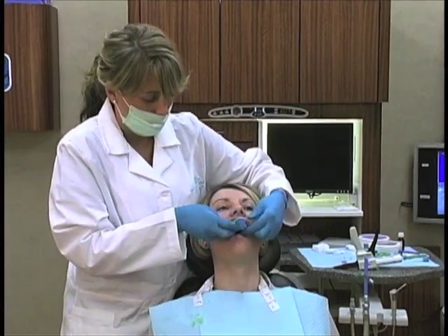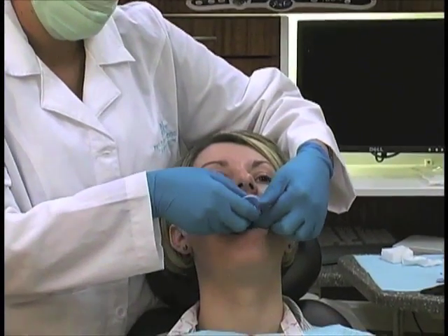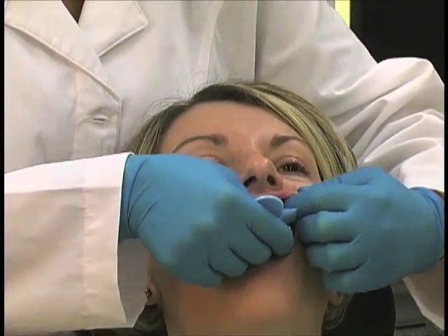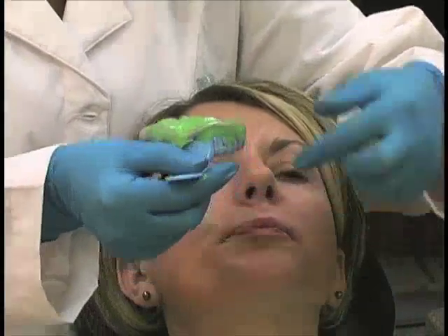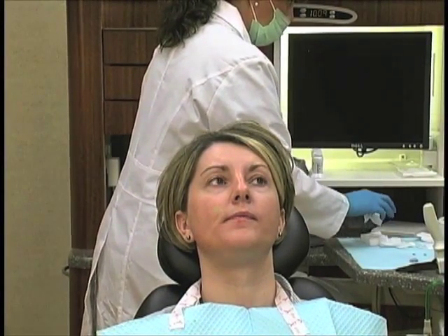Okay, so after the allotted time, here again, this material is firm, so it may take a little bit of time to remove it. One thing to be careful of is that if you have patients with older bridge work that has high water pontics, you want to make sure you block that out with some sort of wax so that we don't engage those undercuts.